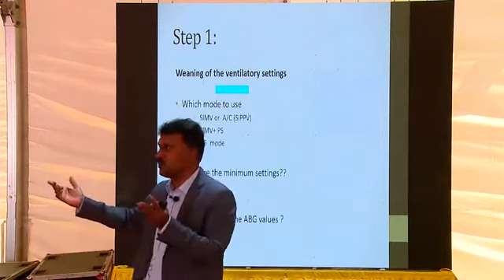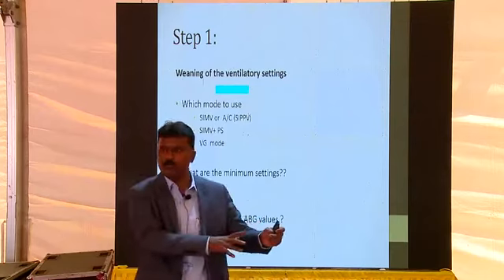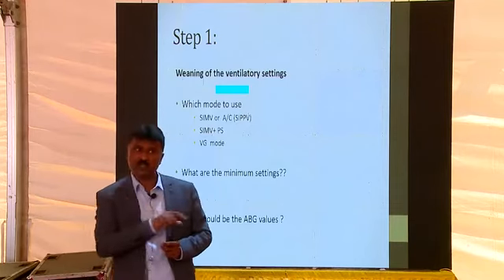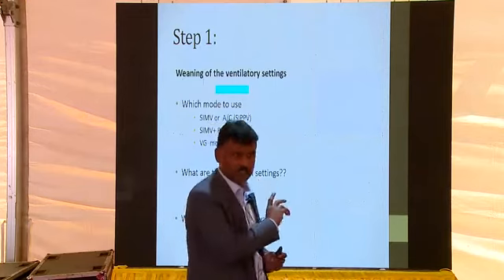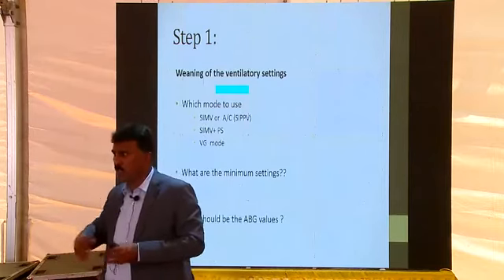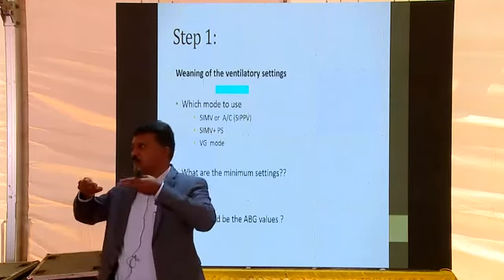All the 60 breaths are supported. My worry is, can I just suddenly take him off? Suddenly I'm taking out, I'm saying now, buddy, you breathe on CPAP. He may not breathe very well. Assist control people say no. See, assist. Suddenly take him from 60 to 0 breaths supported. But no, it's okay. Supporting all is fine. It is not like only I am giving the breath. The baby was taking the breaths; I was just boosting them.